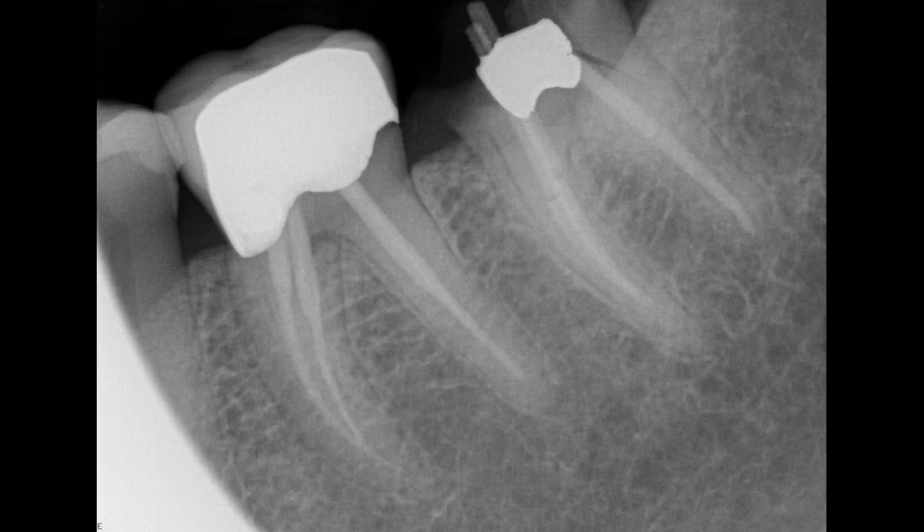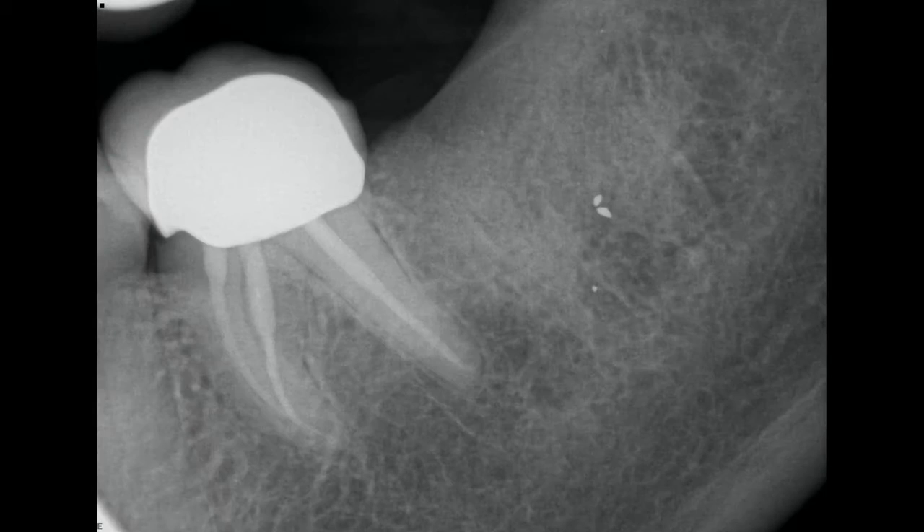We scheduled the surgery. I removed the tooth and placed an artificial bone graft. You can see in this image that it has integrated very nicely and will do an excellent job of preserving the bone so that in the future I'll be able to place a good size implant and restore function back to that area.